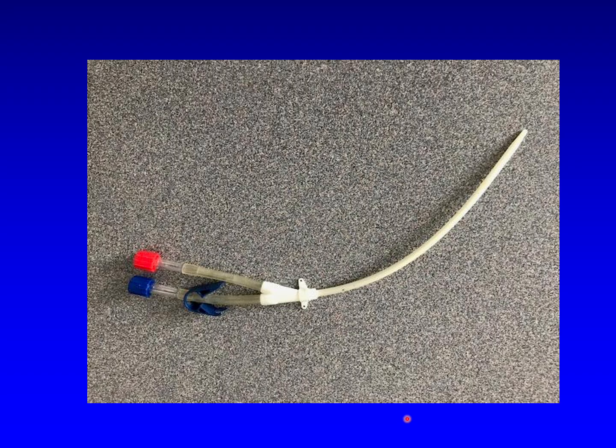Here's a dual lumen catheter, which is essentially two catheters placed side by side and fused, each with its own lumen at the tip and each with its own side pores, allowing for better blood flow. The reason they are labeled red and blue is not that they are arterial and venous blood, because they are both venous, but so that we know which one is leaving the patient and which one is returning.